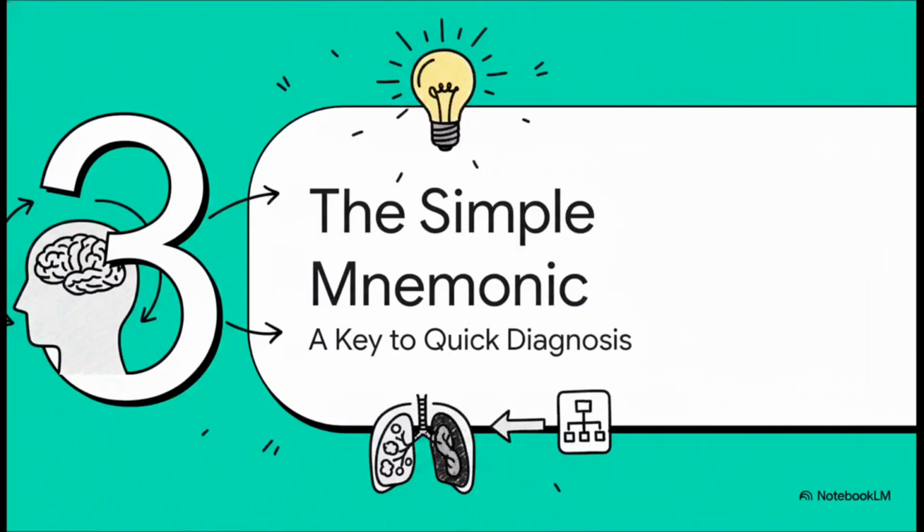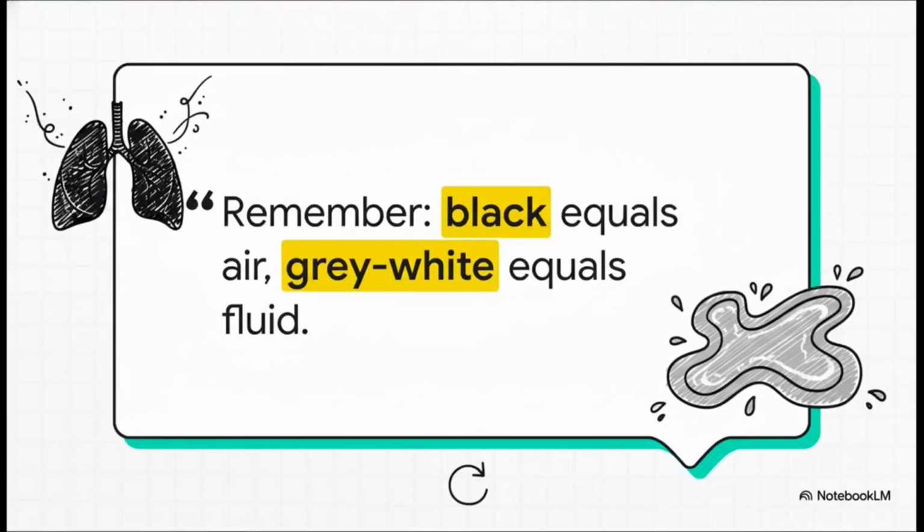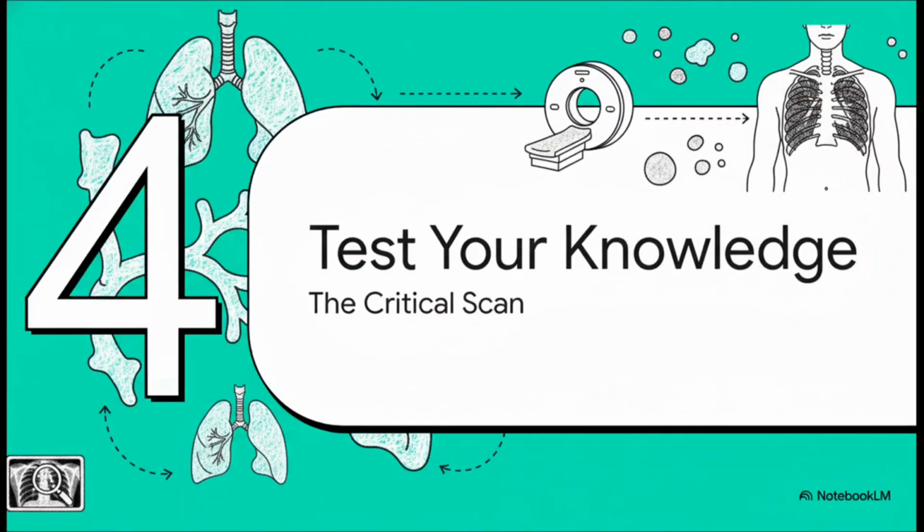Now I know, that's a lot to try and remember when you're in a high-pressure spot. So what you need is a mental shortcut, right? A simple mnemonic that just cuts right through the noise. If you remember absolutely nothing else from this, please remember this. Black equals air, gray-white equals fluid. Say it with me. Black equals air, gray-white equals fluid. That's the phrase that's going to pop into your head and give you the right answer when you need it the most.